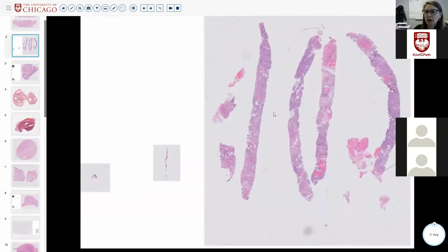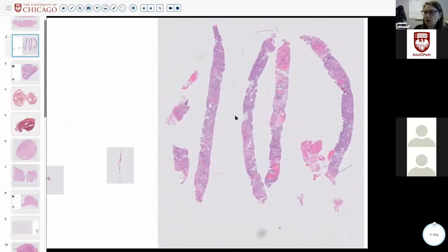All right, number 2, it's called exophytic or parasitic nodule sometimes. The nodule of lymphocytes with thyroid follicles doesn't have a name, but that process of amputation of those little foci is called exophytic or parasitic.